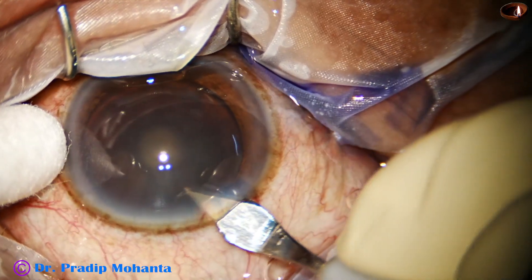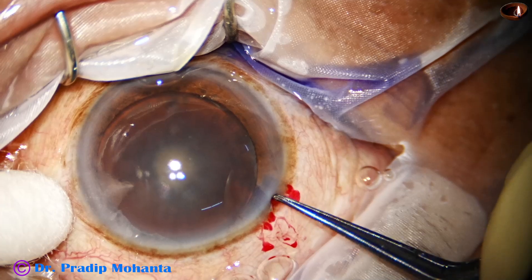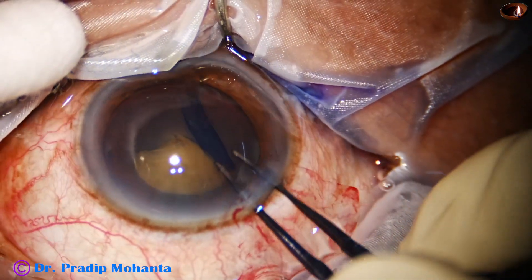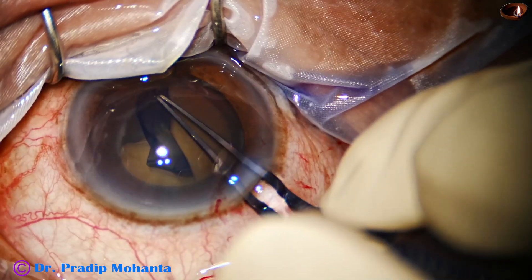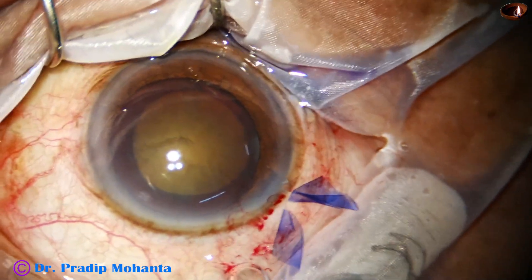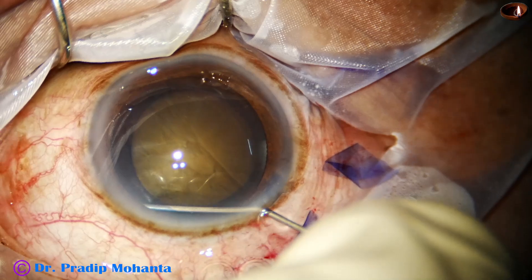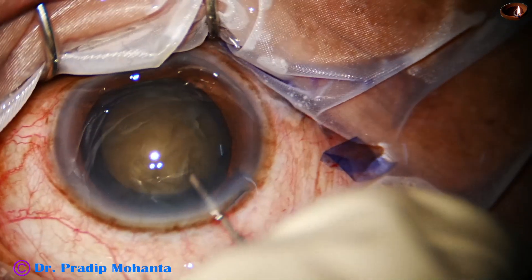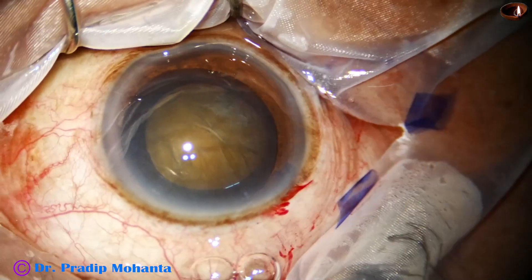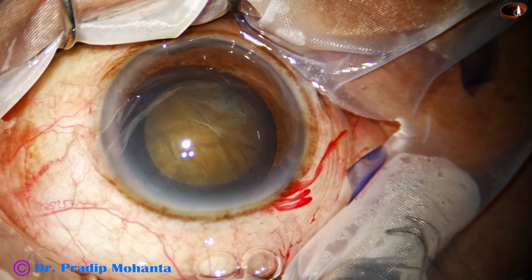Now I am enlarging the main wound a bit so that the handpiece gets enough space to move around and the sleeve is not squeezed. In hard cataracts, if the sleeve is squeezed by a small wound size, there is more chance of wound burn. But if the wound has enough space so that the phaco needle can move around and the sleeve is open all around, and fluid is moving all around the phaco needle, the chance of wound burn is less.